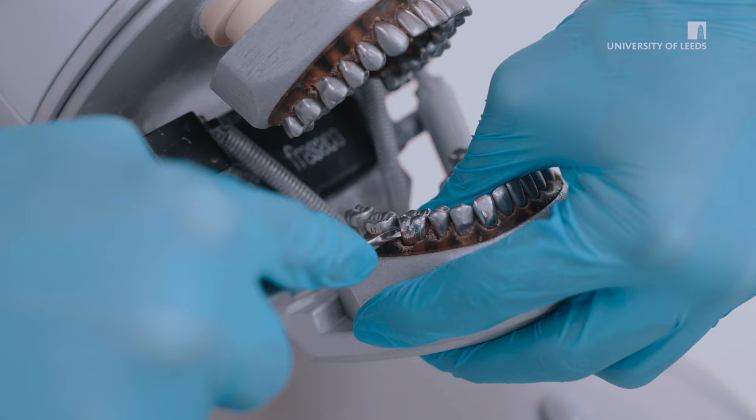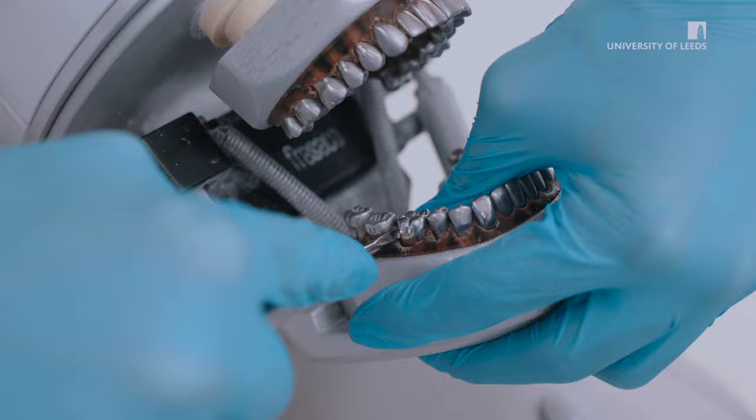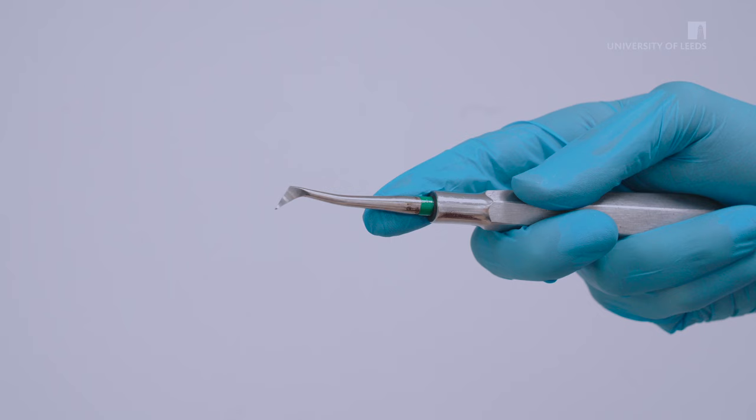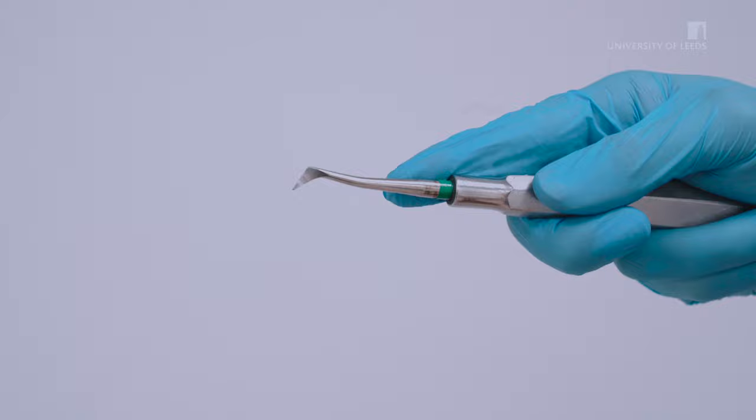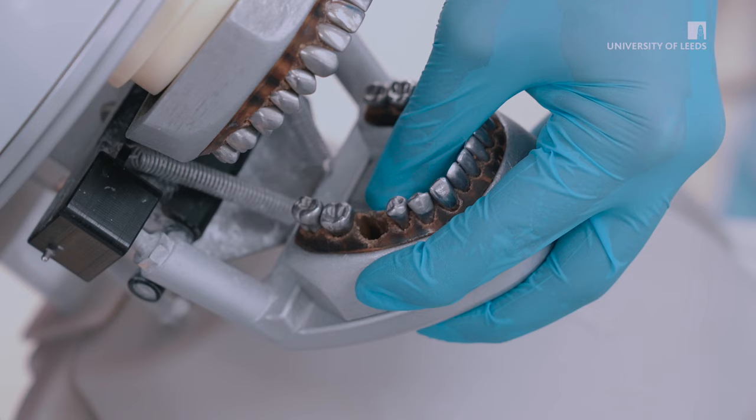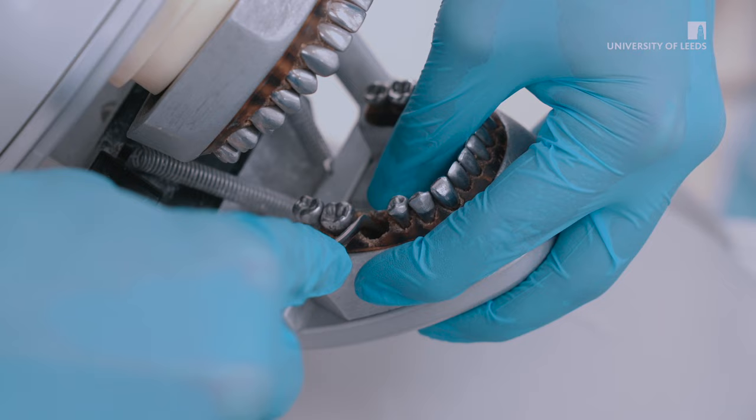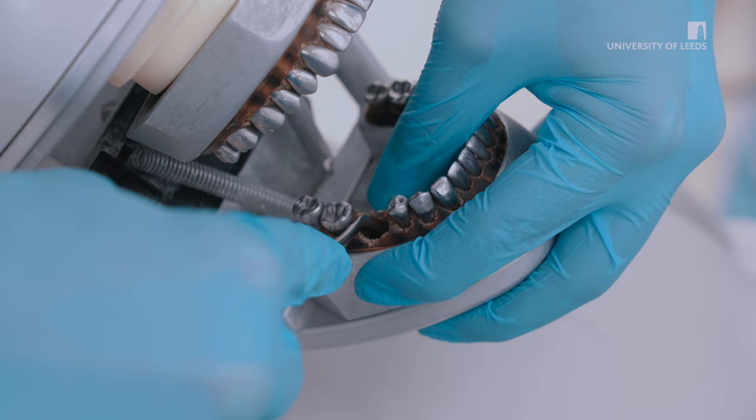Caution must be taken not to use the adjacent tooth as the fulcrum as this risks unnecessary damage to that tooth. The wheel and axle principle is commonly used with criers elevators to remove retained roots. The sharp blade engages the retained roots and they are carefully rotated out of the socket. This is very useful in multi-rooted teeth where a root may have fractured during an extraction and the criers can be used to break the interceptal bone to gain a purchase point for elevation of the fractured root.